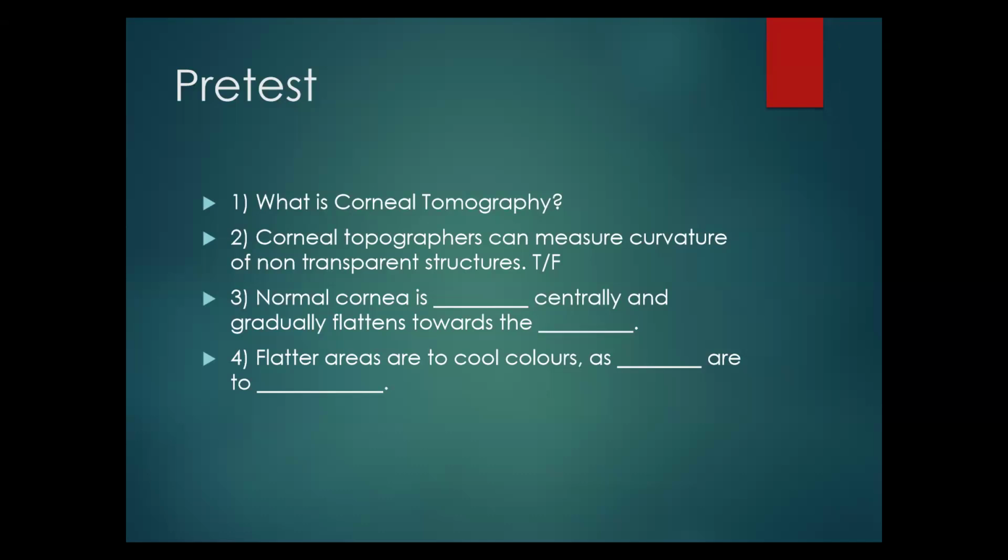Somebody was saying something about a 3-dimensional view. Well, I didn't understand you clearly when you were trying to explain that first one, but I didn't quite hear anything about the concept of tomography, just like I mentioned now. So I didn't hear that anyway. So I was trying to draw your attention to it.